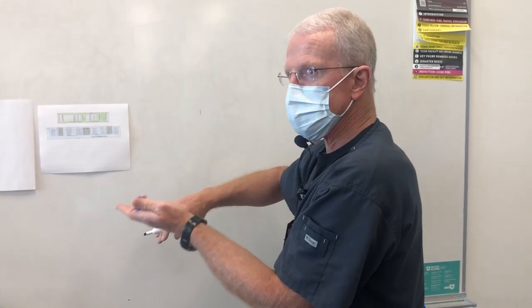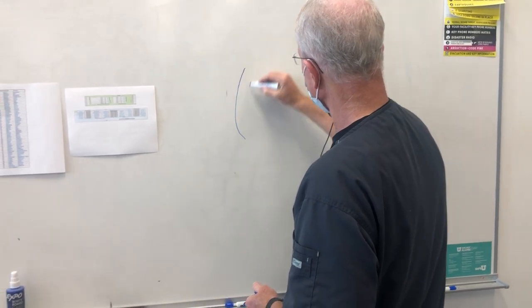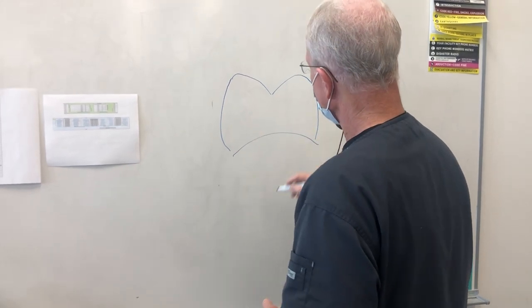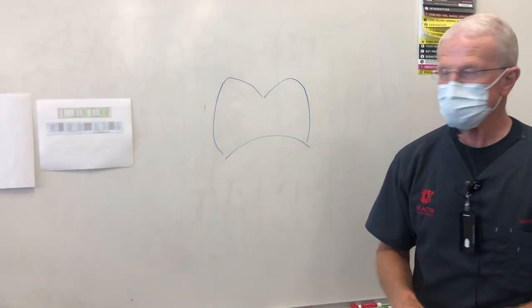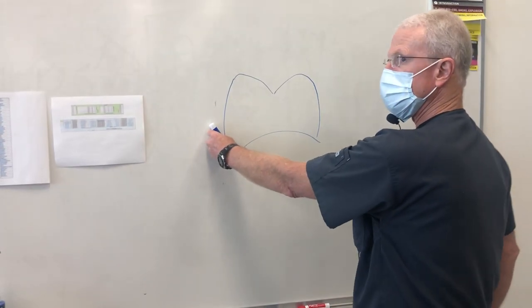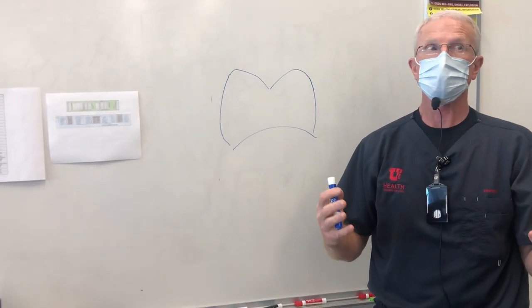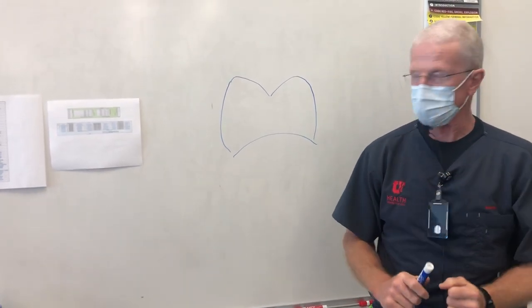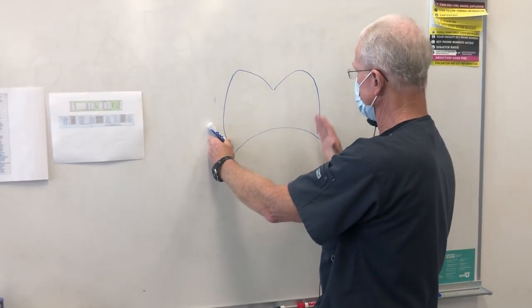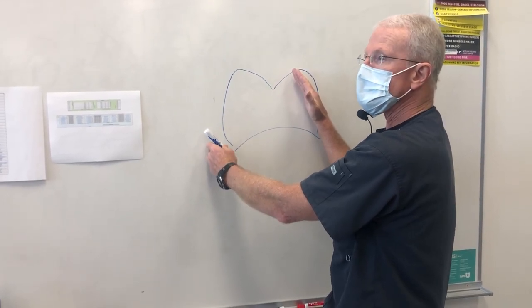So if we were to turn the Typodont upside down, like we often look at these, and look at one of those upper molars preoperatively, many of you have come up to me and said, well, okay, I'm going to do two plane facial. Do I line up with this, or somewhere in between? And it's confusing. I can see why you're struggling with that, because if you line up with this, that's crazy, and you're going to have to put an axial wall like this on the opposite side. So do this.